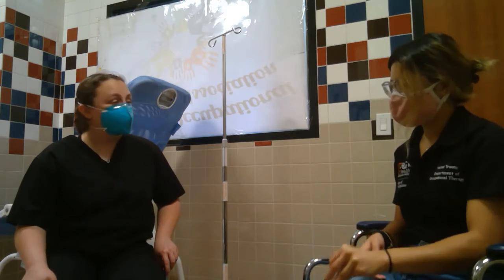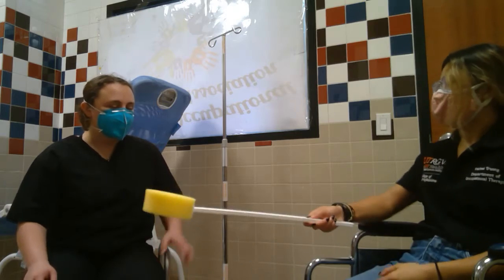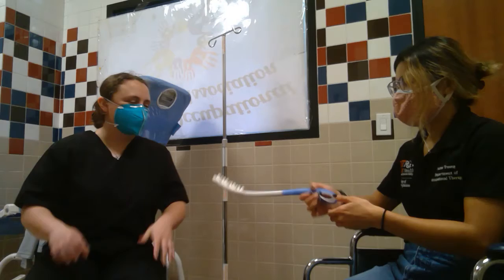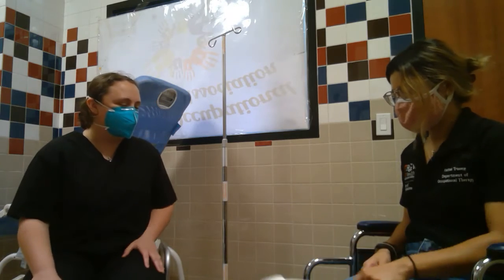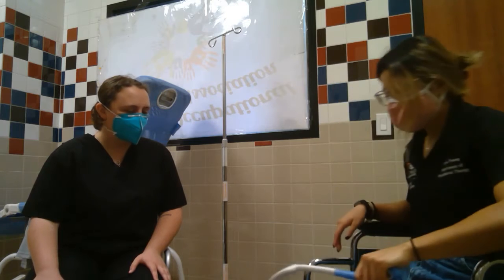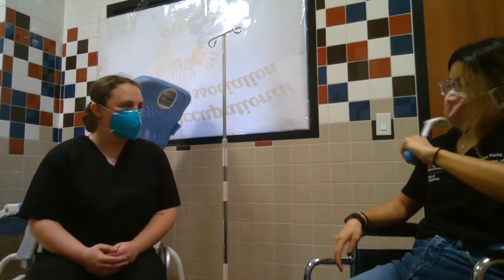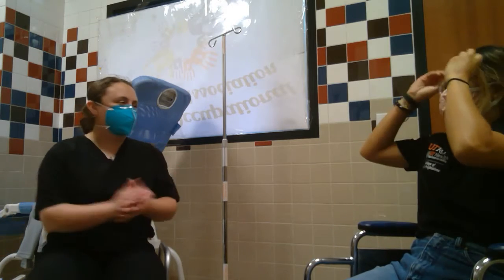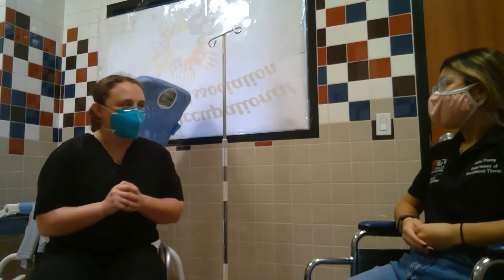Oh, this does make it easier. It makes it a lot easier, right? Less movement. Get to really wash yourself. Here, we'll go ahead with this pretend little handheld shower head. Oh yeah, I don't have to stand for too long because I can't stand so long. Awesome, great job. And that tub bench we'll get to show you a little bit later. Okay.